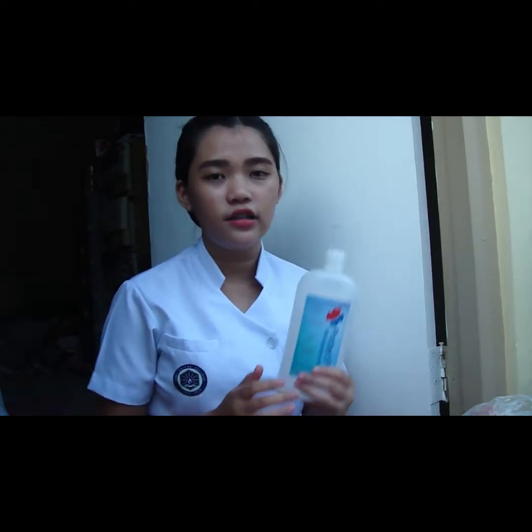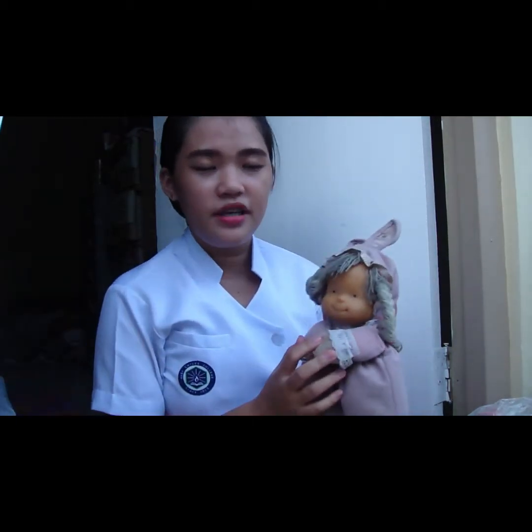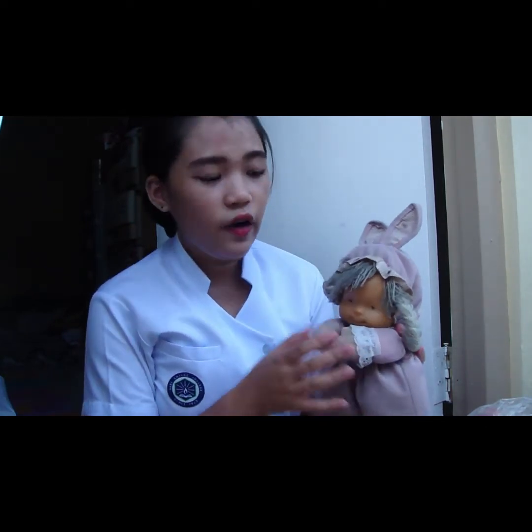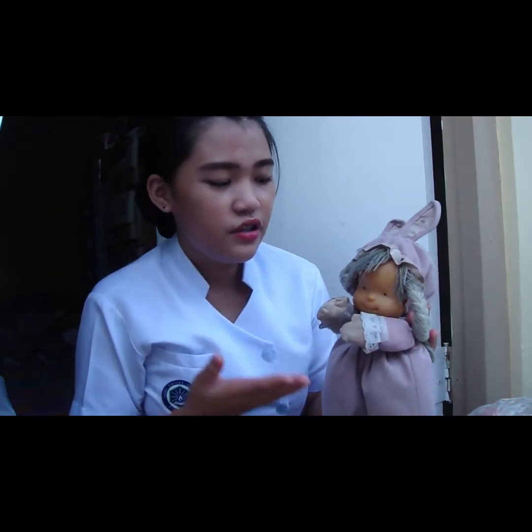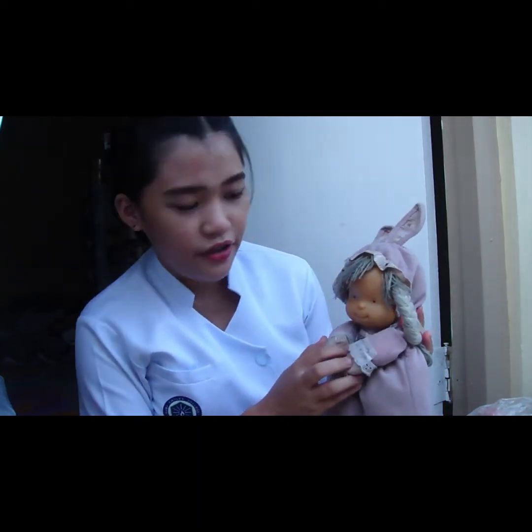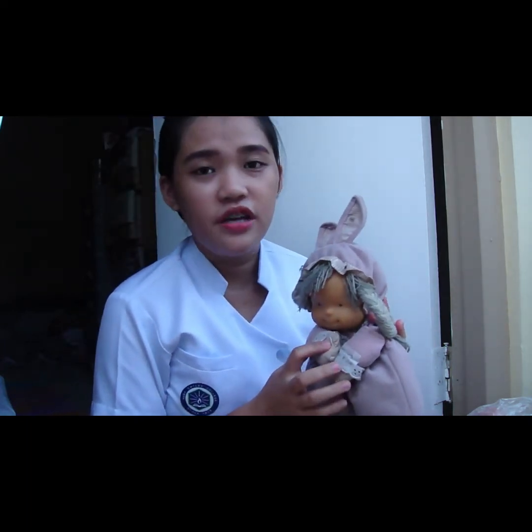So, the first thing that we're gonna do in the procedure is to sanitize our hands by using an alcohol rub and observe other appropriate infection control procedures. Now, for the implementation, we're gonna introduce ourselves to the client. So, hi, I'm Trinette Cruz, your student nurse for today. And verify the 2 identifiers to ensure that the right patient receives the medication.